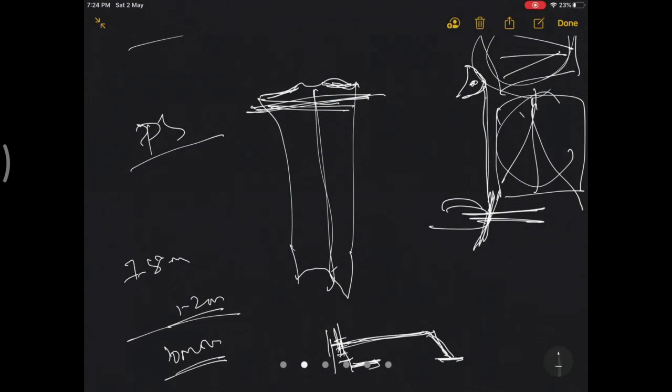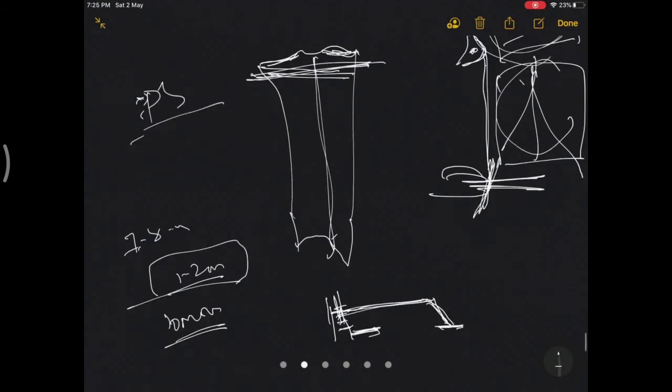Since it is a correctable deformity, the soft tissues are balanced according to that preoperative, normal state. So you will have to respect that, and you will address this lost bone when you take a cut. With all this in mind, you take a proximal tibial cut.